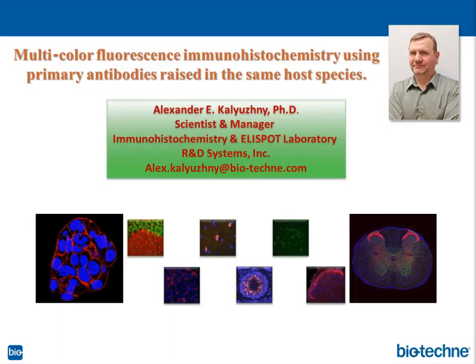Okay. And now Sally has a question asking if you could suggest within how much time post-addition of the secondary antibody the fluorescence should be determined. So the incubation time, this is my understanding. How long to incubate with secondary antibodies to get a signal? Right. Usually incubation is done between 30 minutes and 1 hour. Some people do 2 hours, but you have to watch, and again, you need to run the control to see that there's no non-specific sorption of secondary antibodies the longer the incubation goes on.